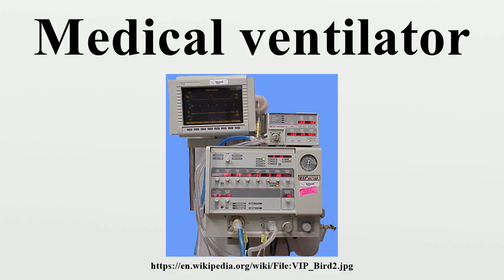In Canada and the United States, respiratory therapists are responsible for tuning these settings, while biomedical technologists are responsible for the maintenance. The patient circuit usually consists of a set of 3 durable, yet lightweight plastic tubes, separated by function. Determined by the type of ventilation needed, the patient end of the circuit may be either non-invasive or invasive.